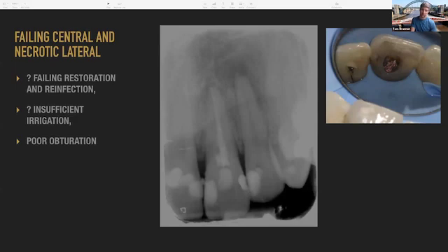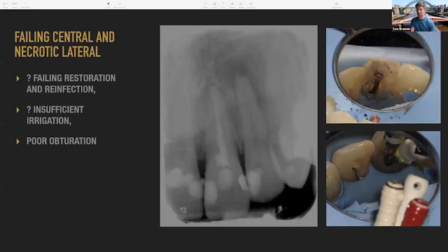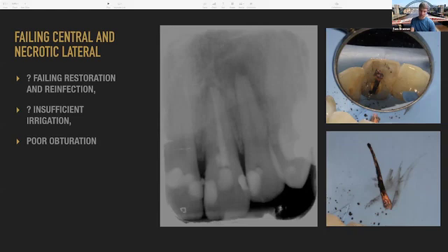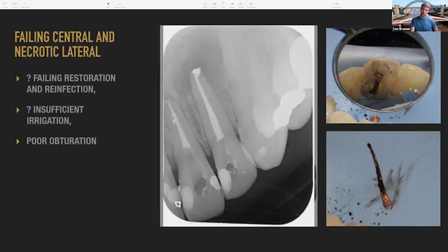But yeah, pain, infection. This is where I've used the braiding technique to get the old GP out and try and take it out whole rather than using any sort of solvents. And you pull it out, and this is where it looks really dirty. You want to make sure that we're cleaning this well, spending a lot of time cleaning it, dressing it. I think I had slightly wider apices where there's been a degree of external resorption, but just make sure you're planning your obturation as well.